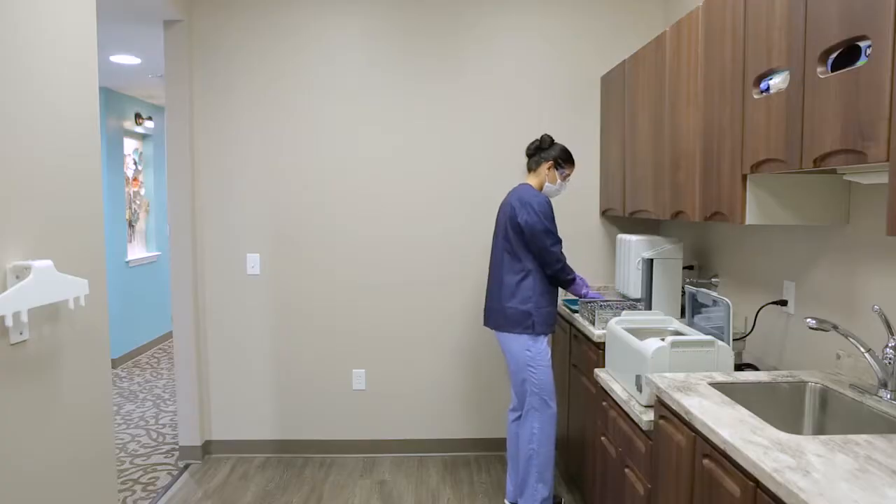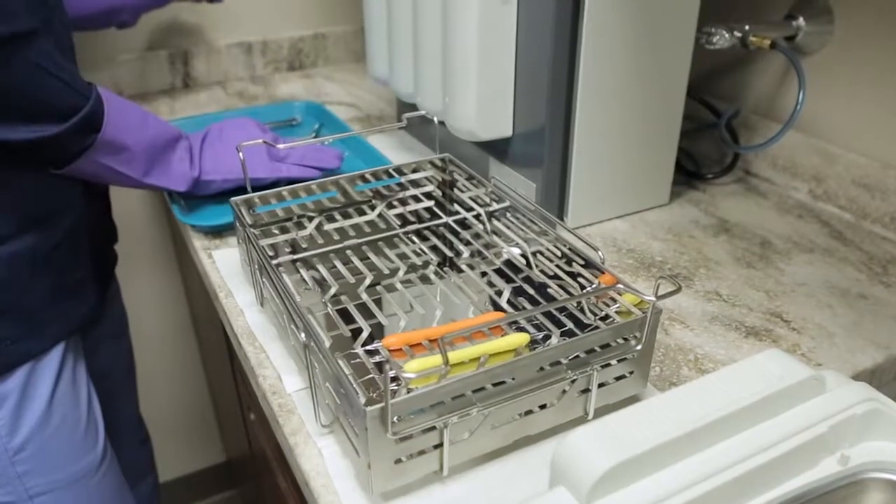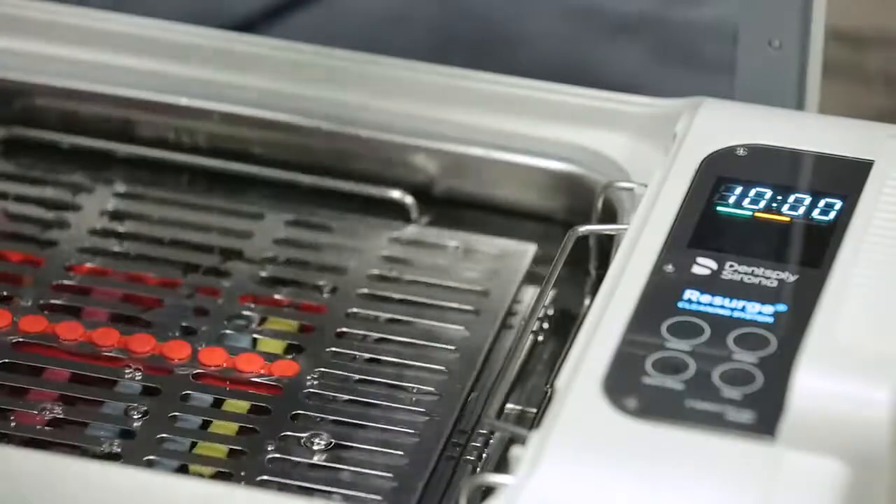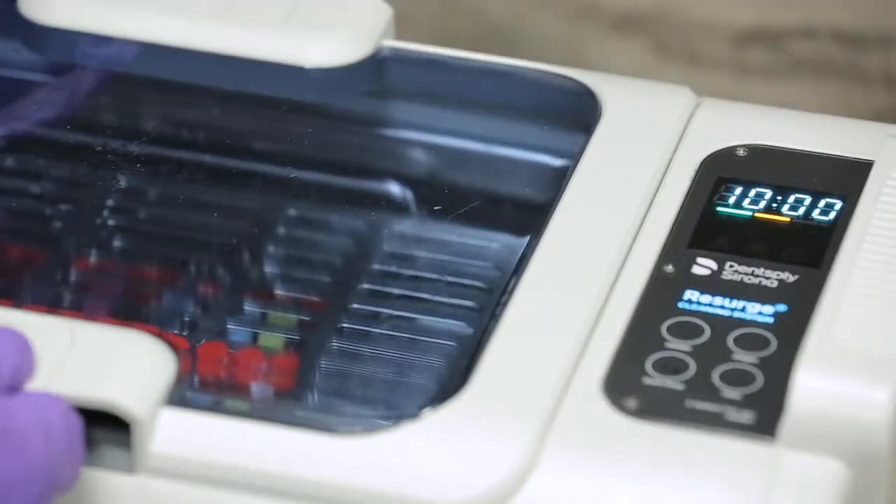Once the timer counts to zero, you are ready to start cleaning instruments. The Resurge Ultrasonic Cleaners use a universal rack system that allows the loading of instruments into a deep instrument basket, stackable trays, or into a variety of standard instrument cassettes. If you need to add water, do so slowly, but never allow the water level to rise above the maximum fill line.